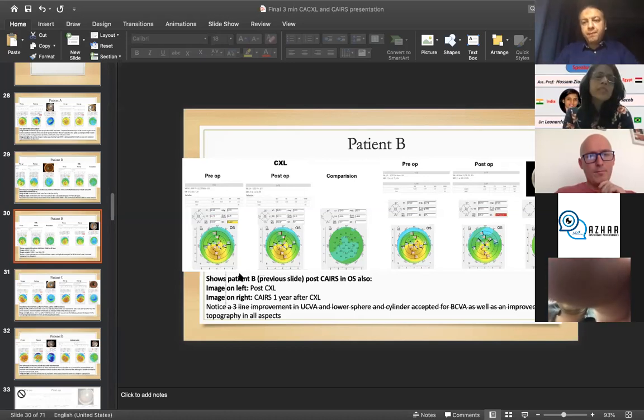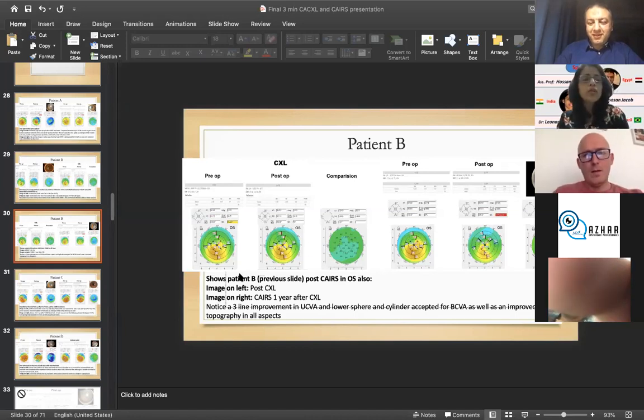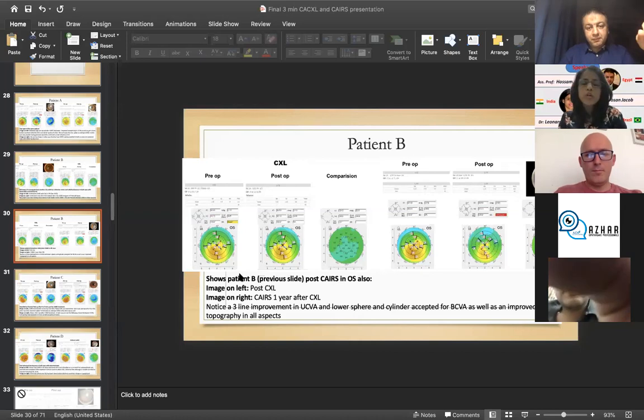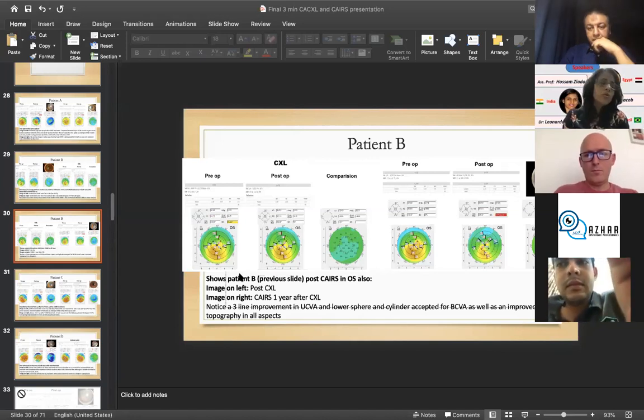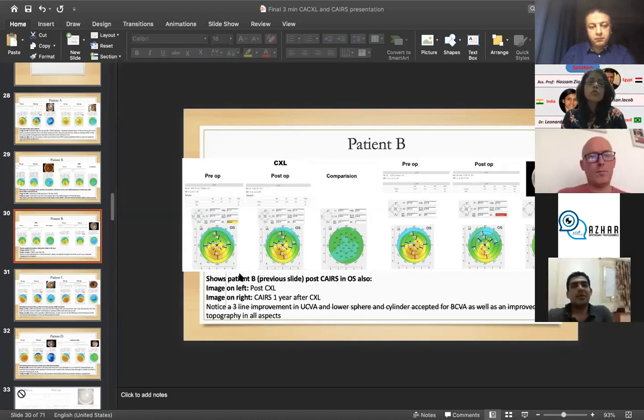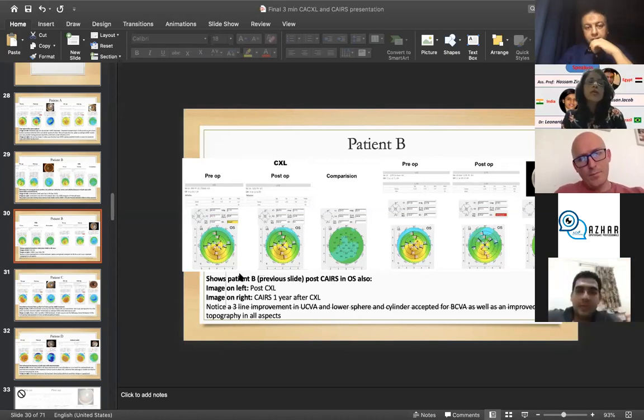Yeah, that's actually a beautiful question. I like that question. Yes, actually, so CAIRS, there is a role for synergy for all these procedures. So you can do CAIRS, bring your refractive error to very good acceptable levels. And then whatever is the remaining residual, you could do either with a phakic IOL or, I don't really like clear lens extraction too much. But yes, if you do that, you can do that.